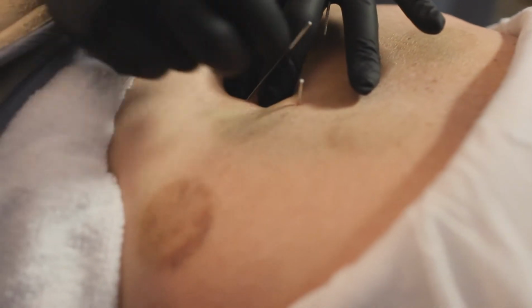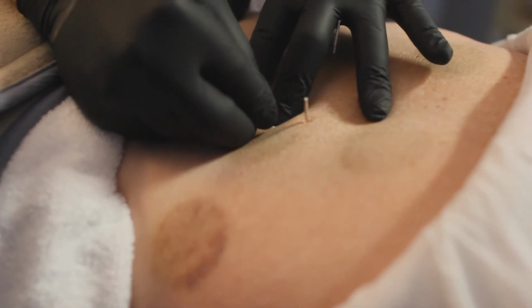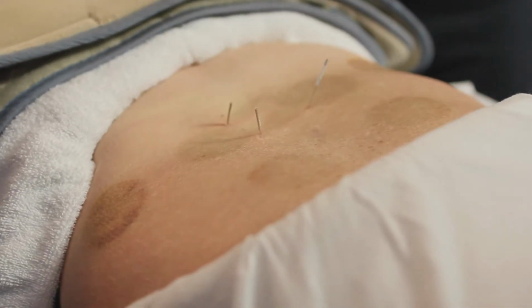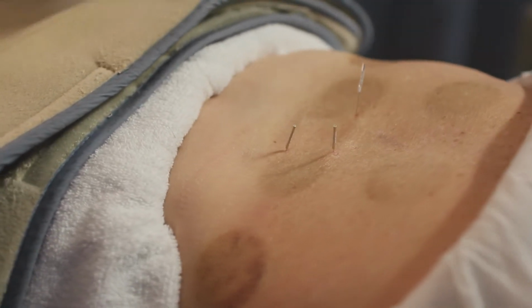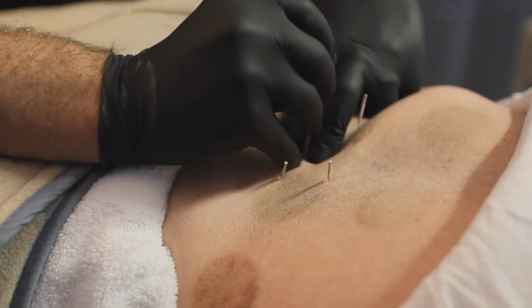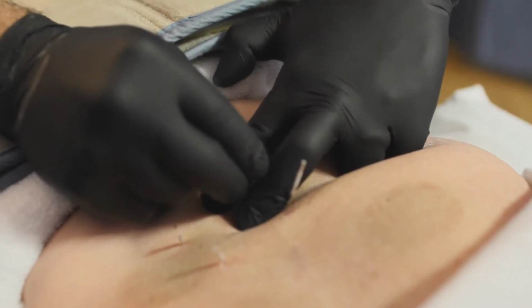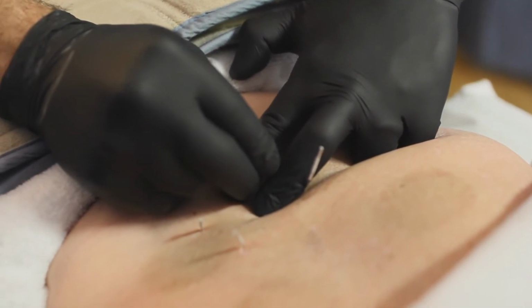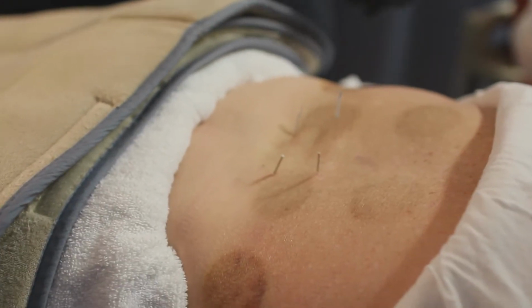Right there, you see that? There. And there. Alright.